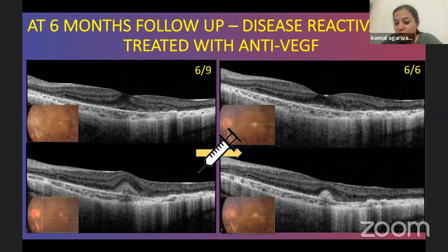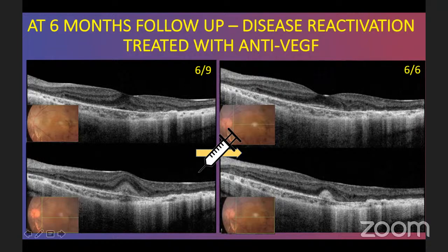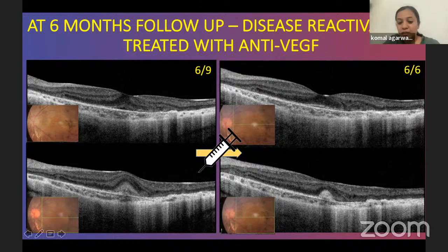We have one more question. So Avnish has put it up here. Best vitelliform lesions and difference from CNV, what are its markers? I am not sure if I get the question correctly, but I guess it probably speaks on OCT. How do we differentiate whether it is a vitelliform lesion or a CNV? Is that correct, Avnish? Yeah, so Vishal and then Dr. Sharath, your views on that?